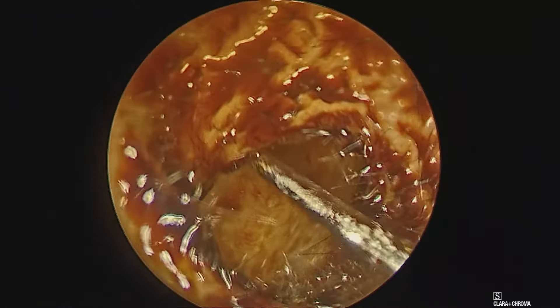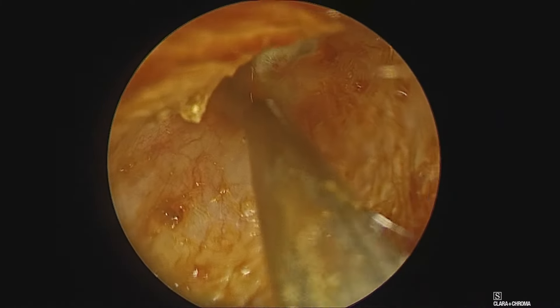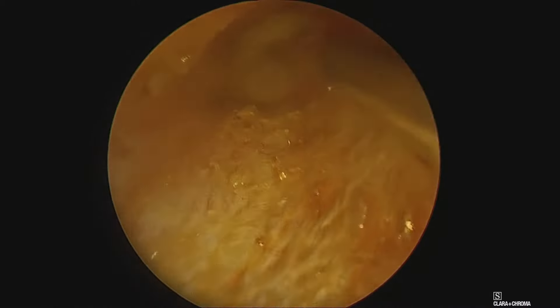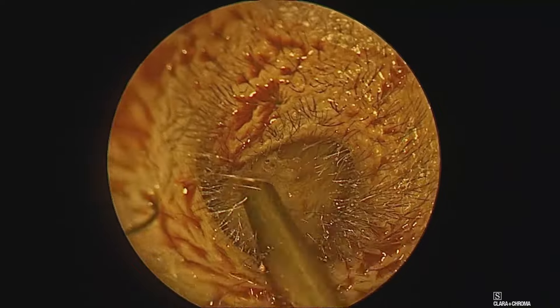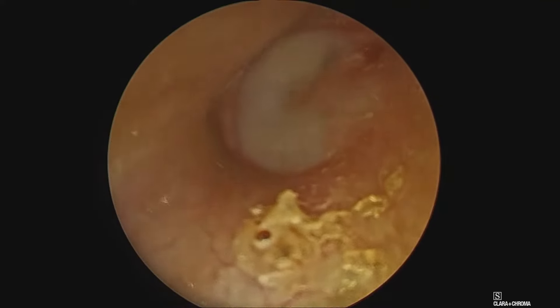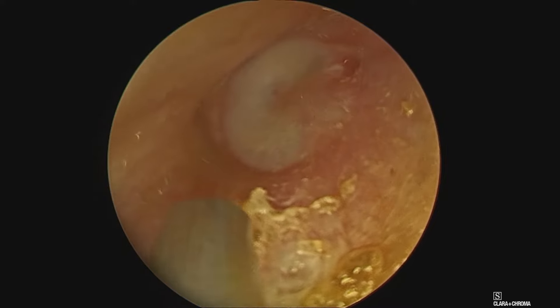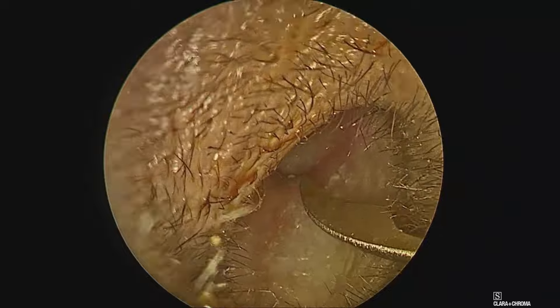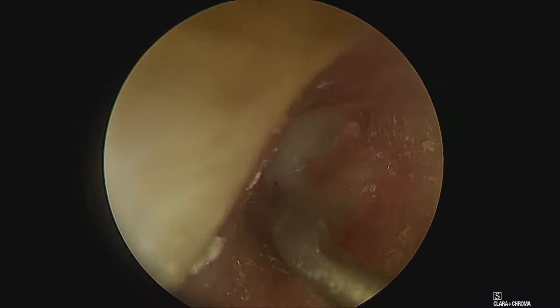Similarly, on the left side we have prepared the part with betadine and cleaned the canal, again using adrenaline-soaked cottonoid to achieve hemostasis from the tympanic membrane. Using a sickle knife, a radial incision is made in the antero-inferior quadrant.